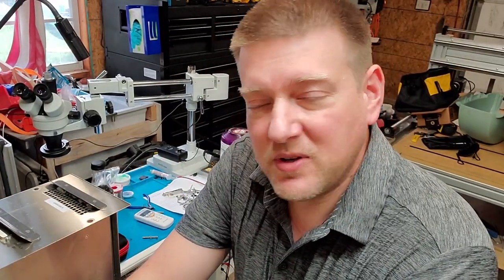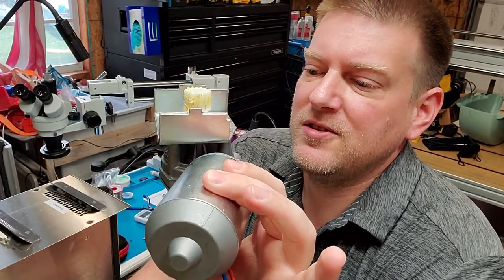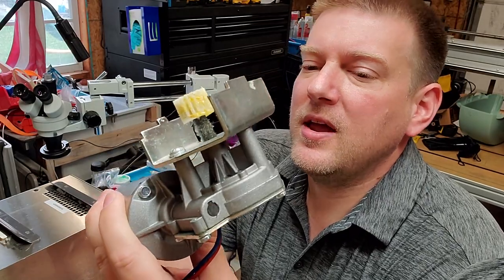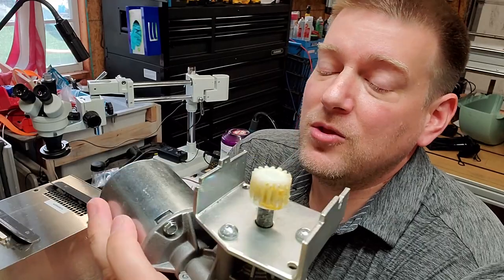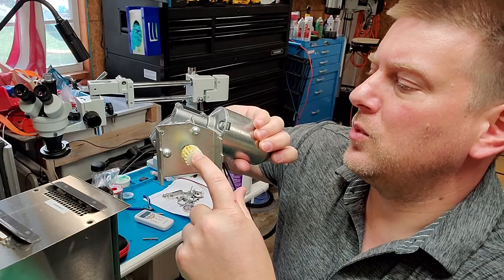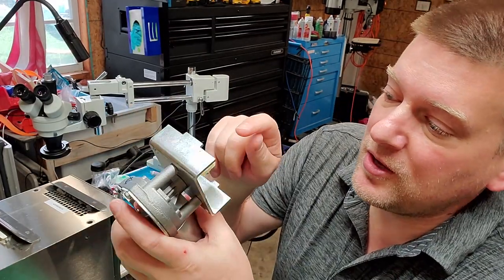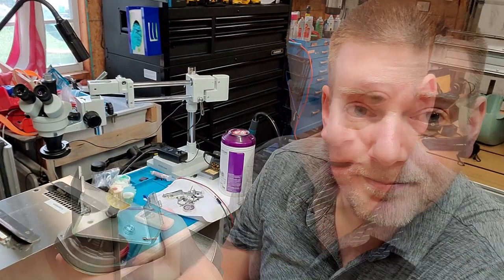And right after we're done with that, we're going to tear into this guy. We're going to do an investigation on this motor. This comes out of a patient lift, an Arjo patient lift. And this part was ordered, and for some odd reason, I don't think that this part's bad at all. The weak point on this entire assembly is going to be the nylon spur gear right here, which this one here is not worn down. It's got still good grease on it. Makes me start to wonder, because usually they will break here at the gear before it breaks anywhere else. So let's get into it.